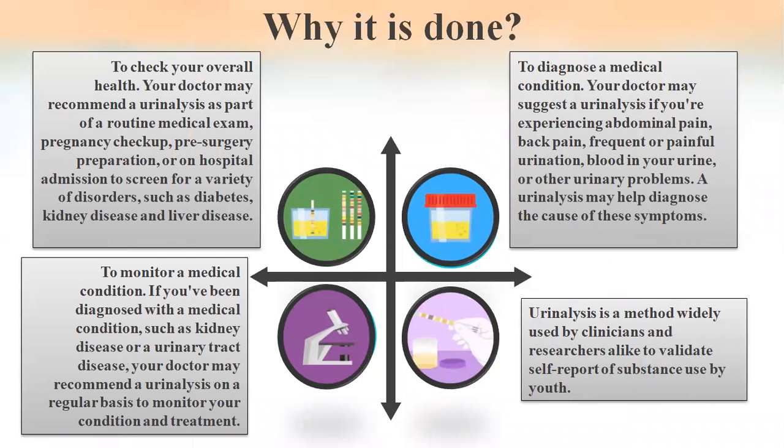Why is it done? Urinalysis is used to check your overall health as a part of a routine medical exam, pregnancy checkup, pre-surgery preparation, or on hospital admission. It is used to monitor a medical condition, for example, kidney disease or a urinary tract disease. It is also used to diagnose a medical condition based on signs and symptoms of the patient, for example, abdominal pain, back pain, frequent or painful urination, etc. Urinalysis is also used by clinicians to validate self-report of substance use by youth.